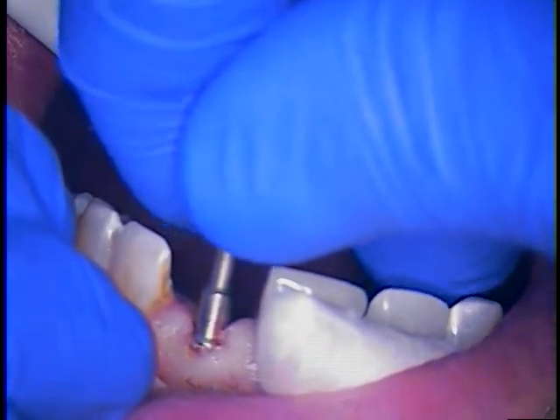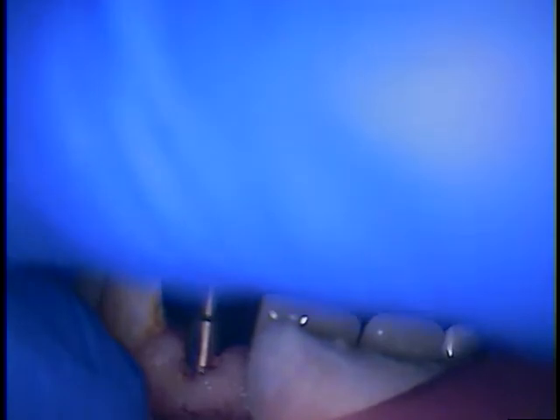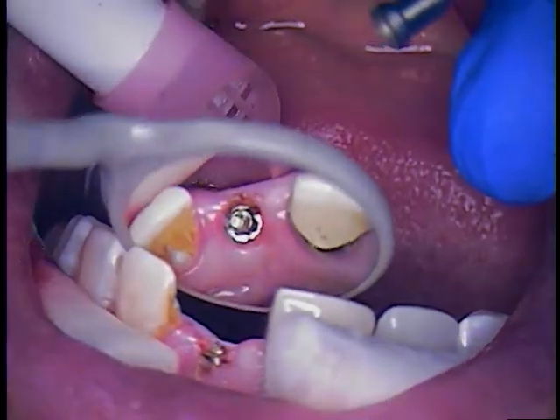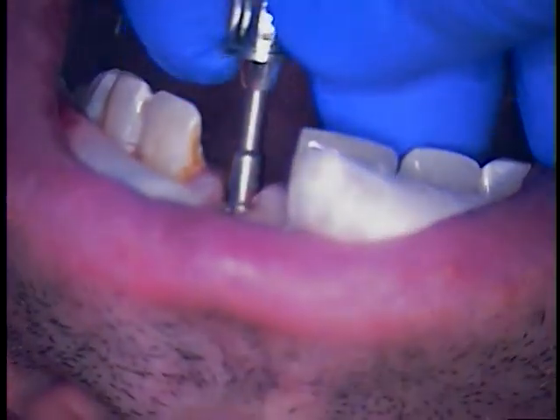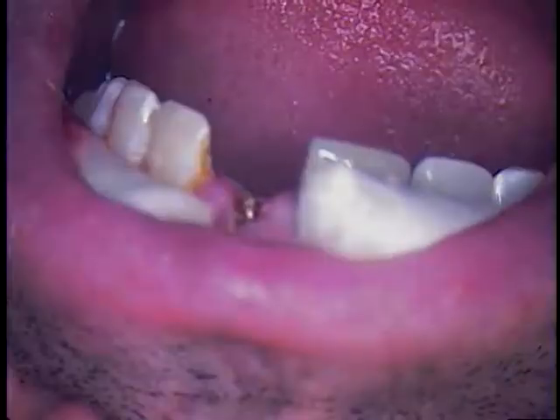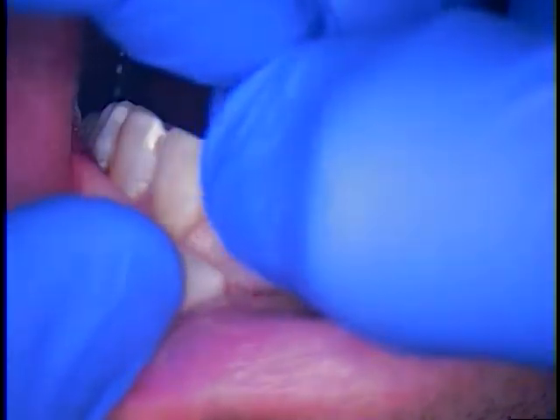All right, let's see if that can be pushed into place like so. And we just reverse it. Let's see how that's twisting out. Let's see if it's the right size. Pushing, turning. Or perhaps because of what's sticking up, it's preventing it from turning. So we'll just take the original driver, push and turn.